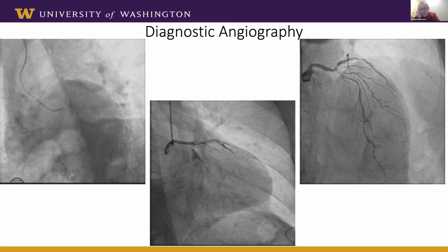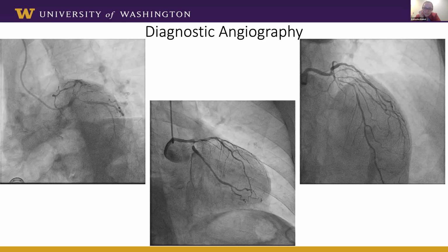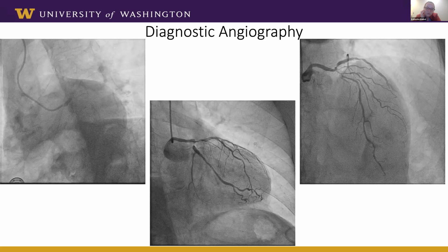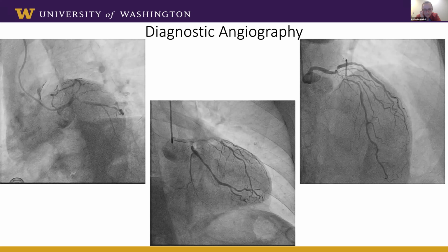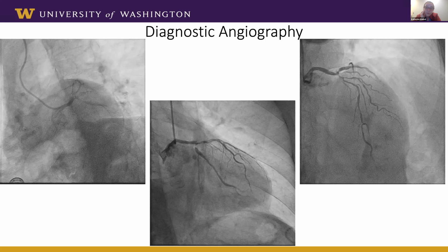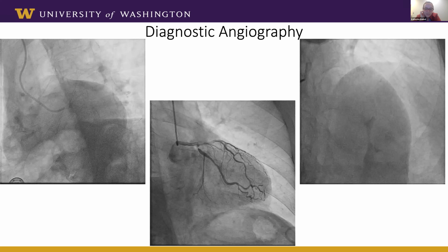So I think you're not going to get away with provisional. I think there's actually a pretty high grade lesion in the middle portion of that diagonal. So I would probably lean towards bifurcation stenting with this, double bifurcation stenting, because the left main is certainly going to be a bifurcation too. Double bifurcation stenting is never a total walk in the park, and so what strategies are you going to choose for both of your bifurcations, and how will one bifurcation influence the other? That's the initial approach I would be taking when looking at this angiogram.